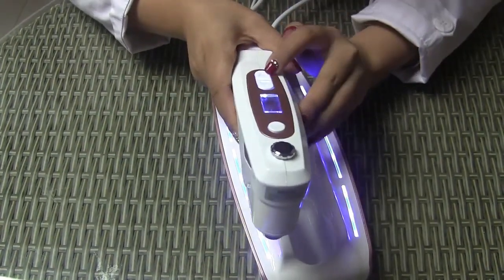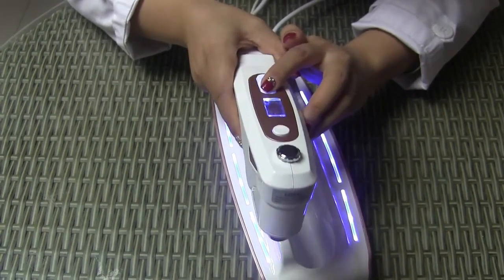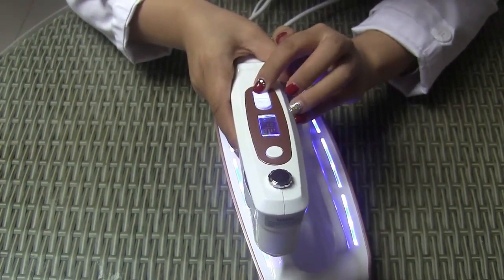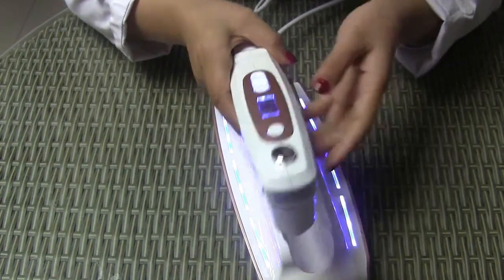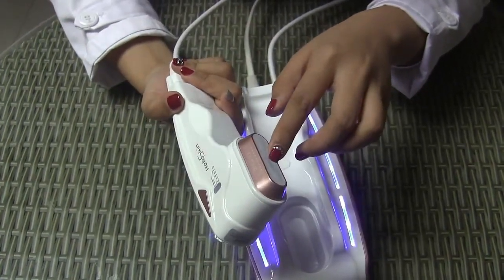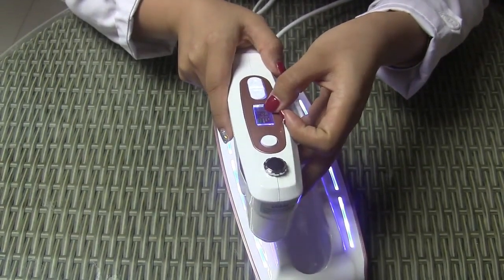And we adjust the energy. The energy is from 1 to 9. We can start from 1 and adjust the energy according to the customer's tolerance. And this one shot has 22 dots, and the 22 dots are within 22 millimeters.